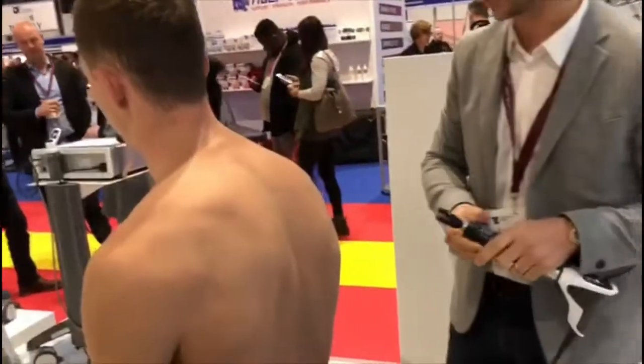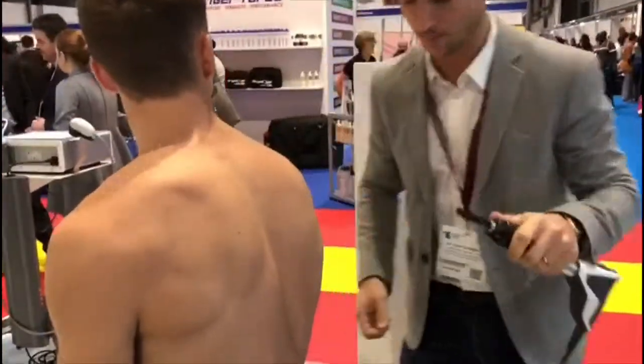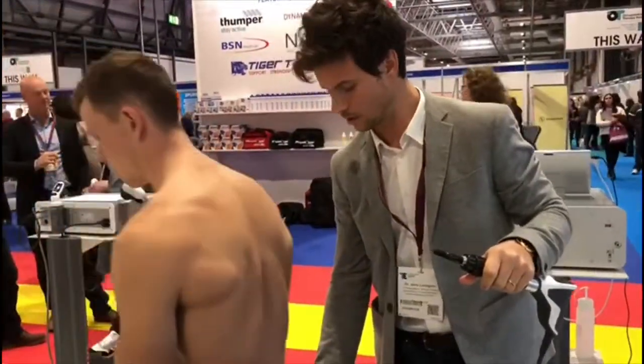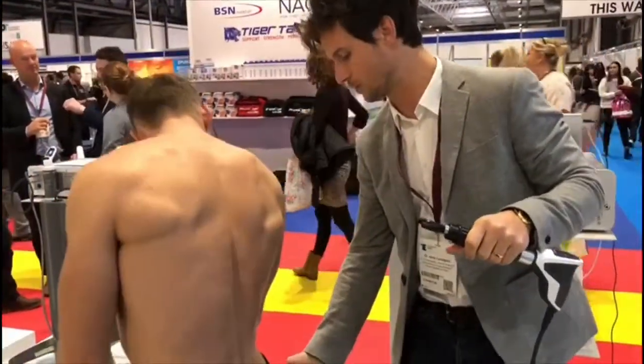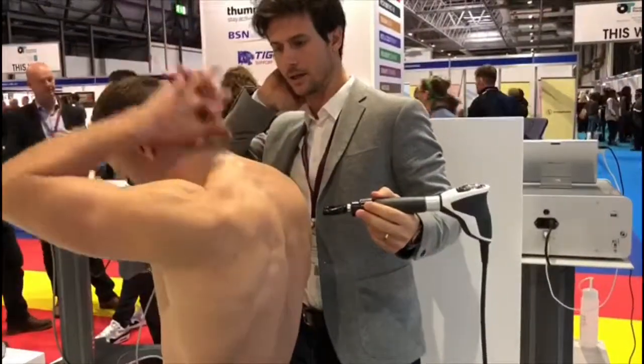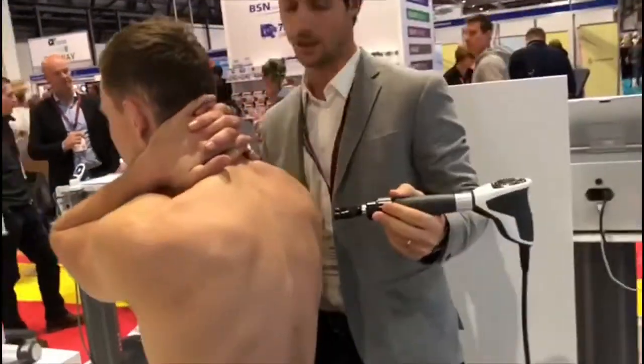We'll try to do this in sitting up, if it's possible. So what you need to do is come out to the side a little bit, not too much — leave me 10 cm. Like that. And then you put your arms behind your neck, like that again, with the elbows like that exactly.